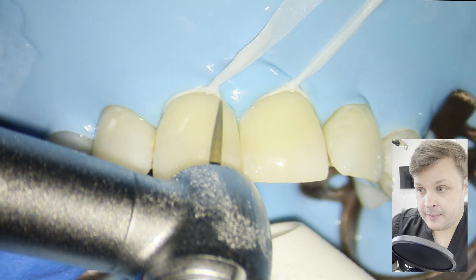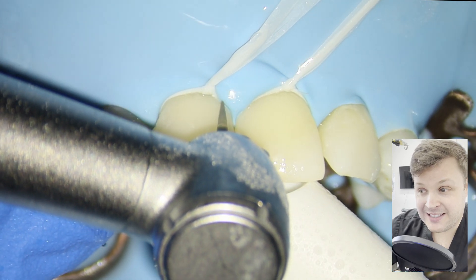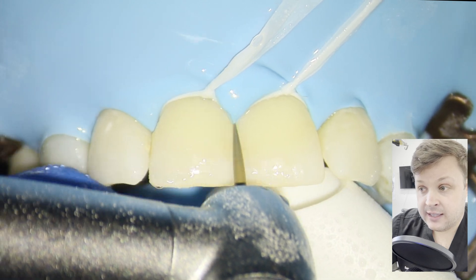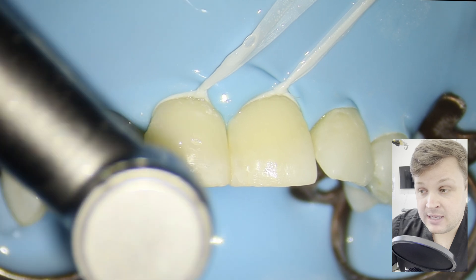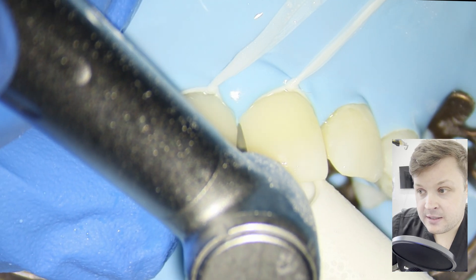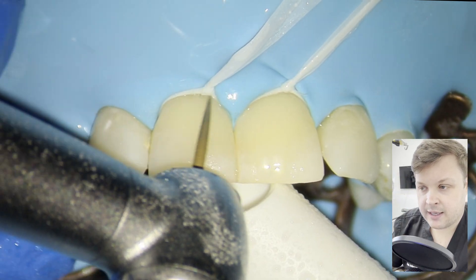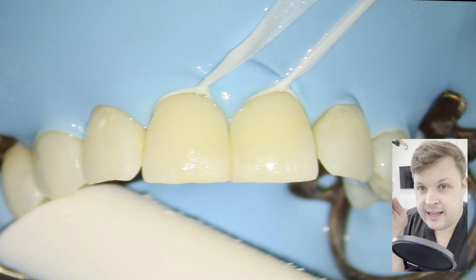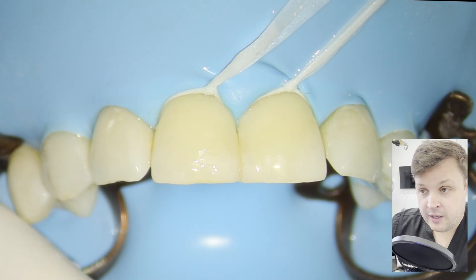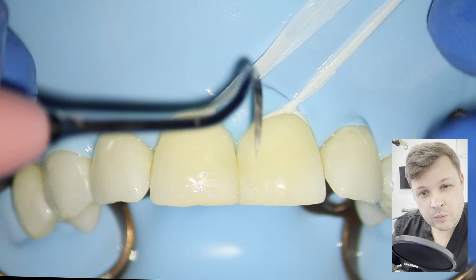Now I'm using a very fine polishing burr, which is quite worn — I just like it because it takes hardly anything away. You'll also notice the clear strip hasn't done a perfect mesial margin on the upper left one — there's an ever so slight ledge. Luckily, because the mesial surface of this tooth was intact, it's just a small bubble of composite that needs to be polished away. If a significant amount of the mesial margin had been missing, this would have created a flat unnatural appearance.